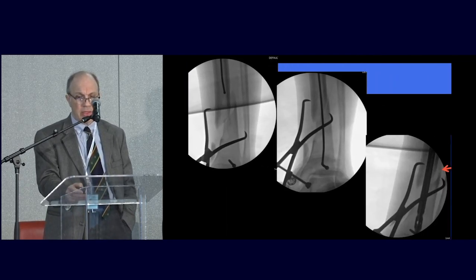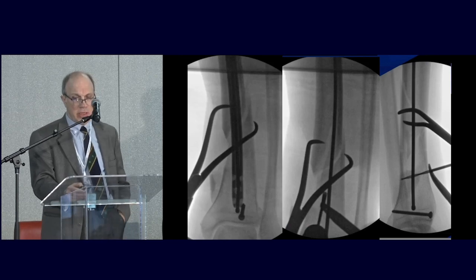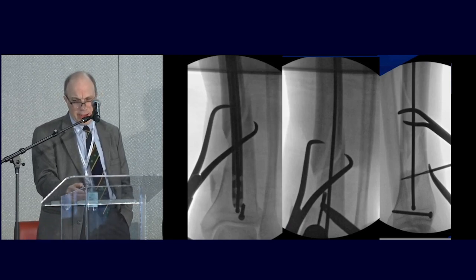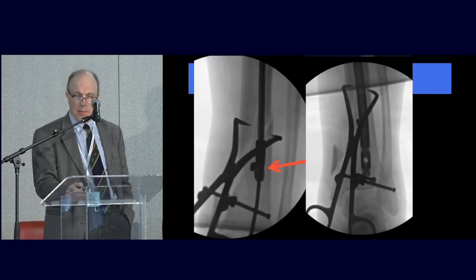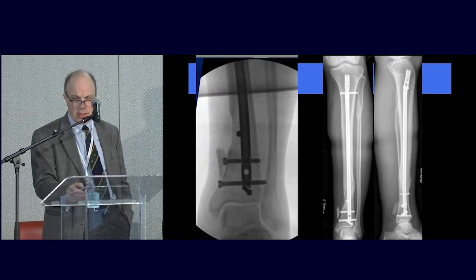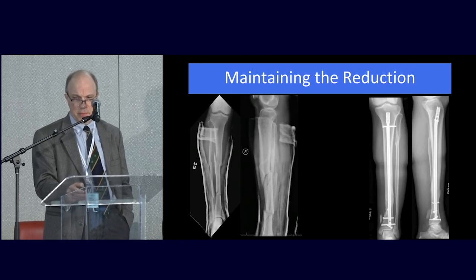This is an example of a distal tibia fracture. Again, we are putting percutaneous clamps, holding the reduction, but it seems to be holding, but not great. Then we put another blocking screw, which I think made life a little easier. It gets our alignment a little better, and by the time we put the nail down, I think the alignment is much better than if we did not have the blocking screw in there.